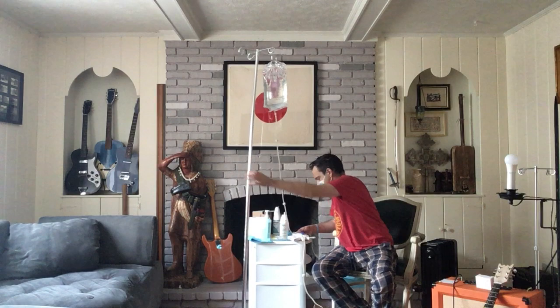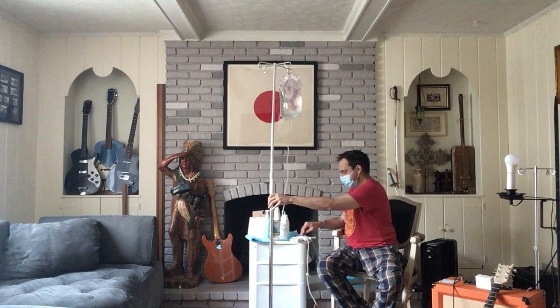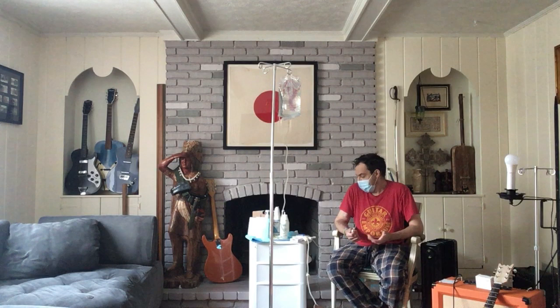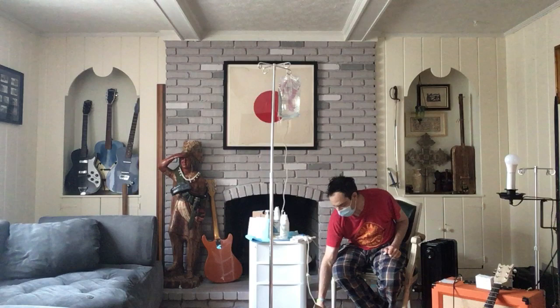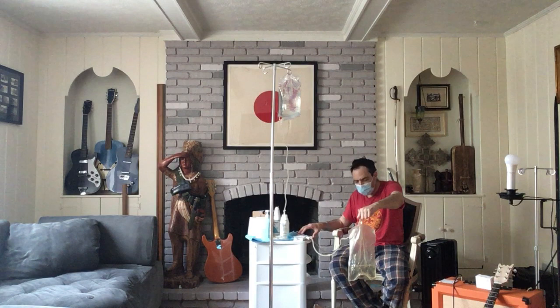Usually there's an extension that comes from the pole to the dialysis divider. I don't have that for some reason, or they break easily. Now you can sit and wait while this bag fills up, which as we see, it's already starting to fill up with fluid that I've had inside of me for the past 4 hours. And that fluid is a clear yellow color. You want to make sure it's clear.